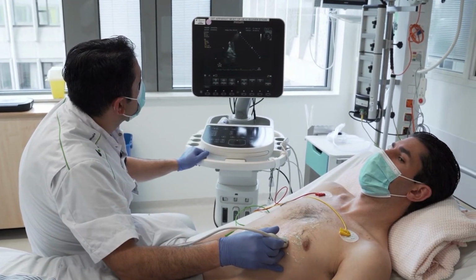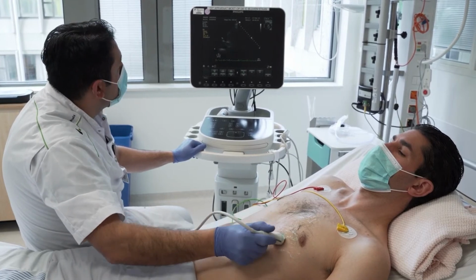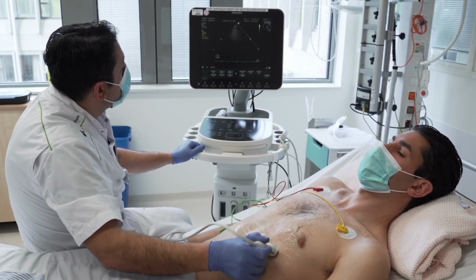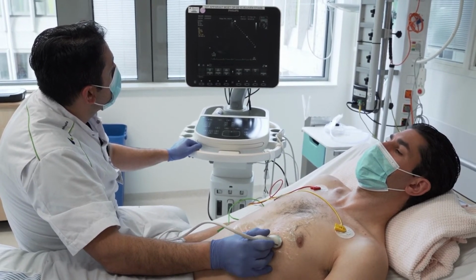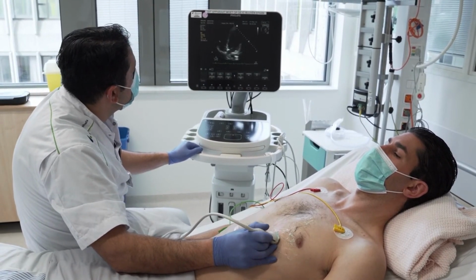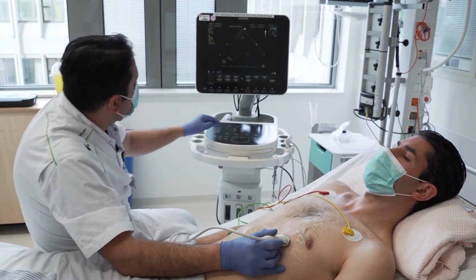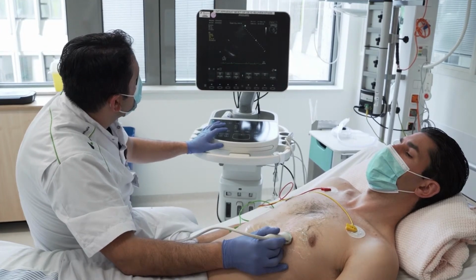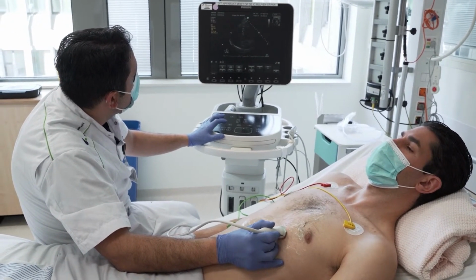From the 4-chamber view, you can also do the 5-chamber view by tilting the probe a little bit, and then you get the left ventricle outflow tract. I think again this is not so important for acute echography, but it's nice to have in your repertoire.